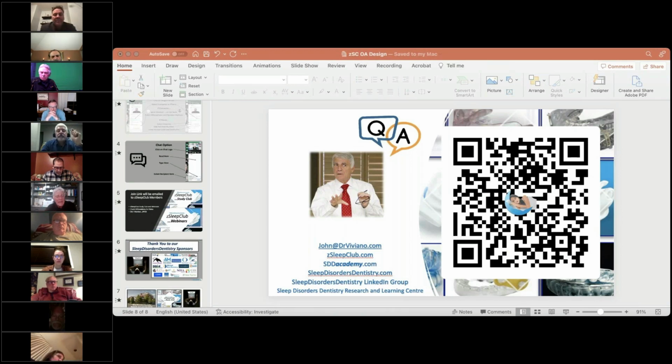All right. Now you go and you heat it up, and you go back to the mouth. But the key is when you put it into the appliance, the appliance has to be spot on dry. No adhesive, but very dry. And as long as the appliance is dry, the material will stick to it. Oh, very good.